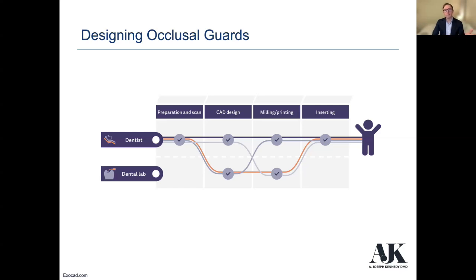But where does the lab come in? I'm admittedly not someone who likes to be the lab technician, nor do I have the time necessarily in my schedule to do these kinds of things. So you can take your digital preparation, you do the preparation, you do your scan, or you get the digital scan. You can either design it yourself or send it to NDX or another lab to have it designed for you. They can either send that design file, that STL file, back to you to print it or mill it, or they can print it and mill it themselves, and then they send it back to you for insertion.